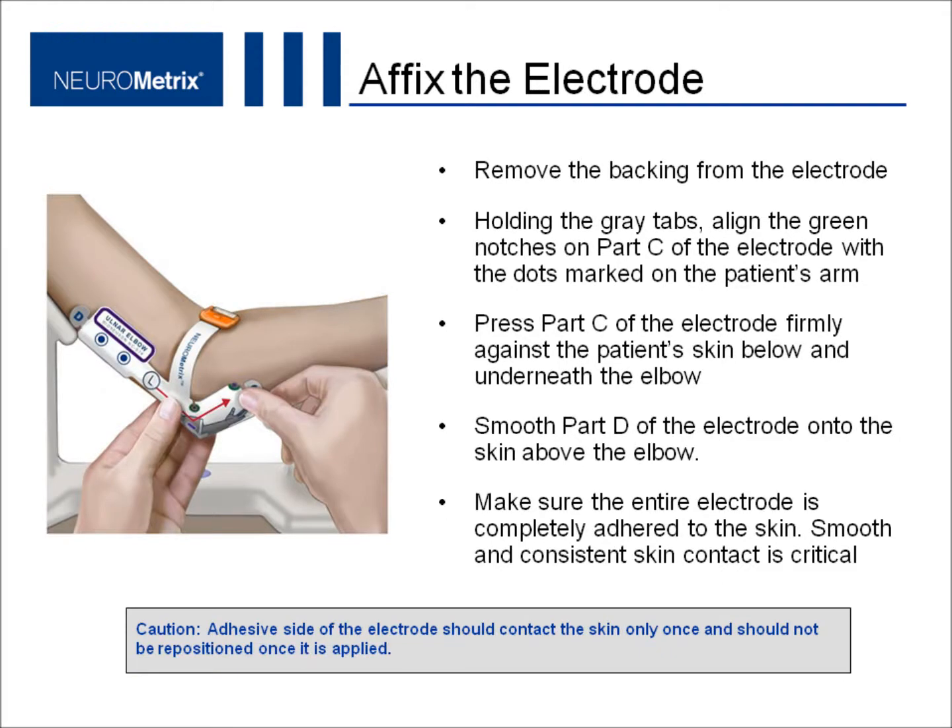To affix the electrode, remove the backing and hold it by the gray tabs. Align the green notches on part C of the electrode with the dots marked on the patient's arm. Press part C of the electrode firmly against the patient's skin below and underneath the elbow. Smooth part D of the electrode onto the skin above the elbow. Make sure the entire electrode is completely adhered to the skin, as smooth and consistent skin contact is critical.